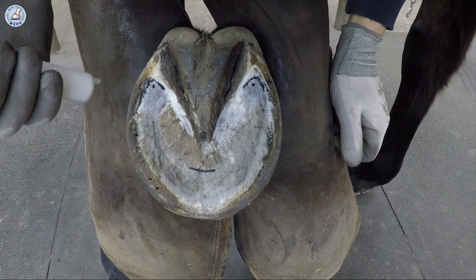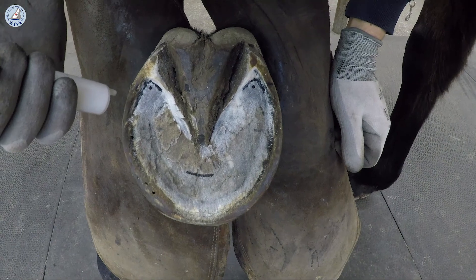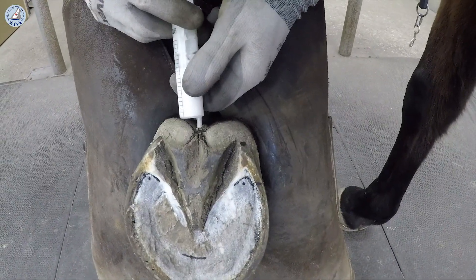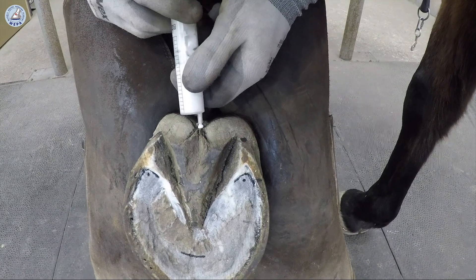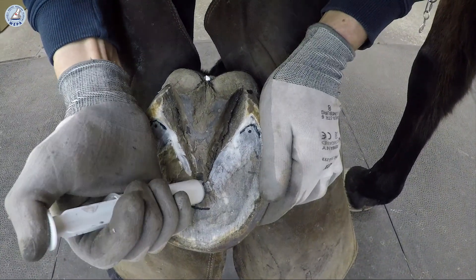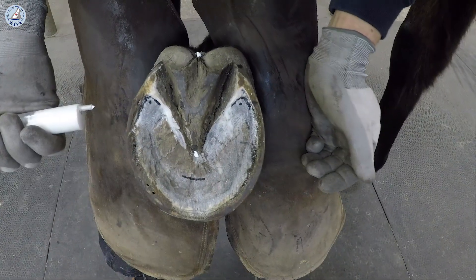Marking the sole for taking x-rays. We mark here at the end — the dot at the end of the frog. We mark the apex of the frog.